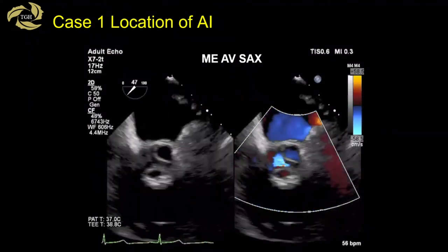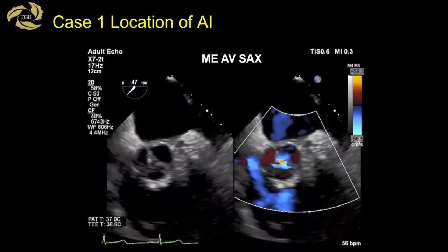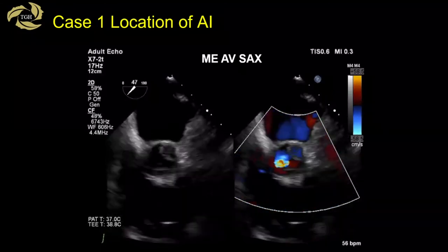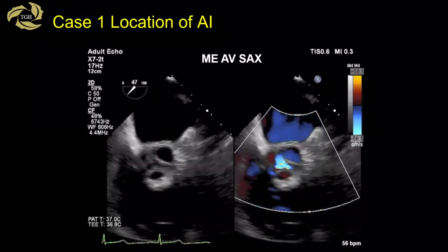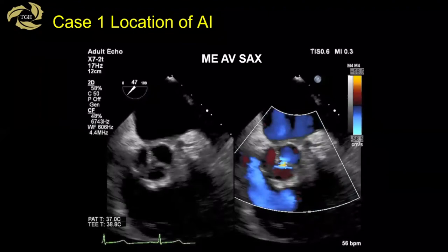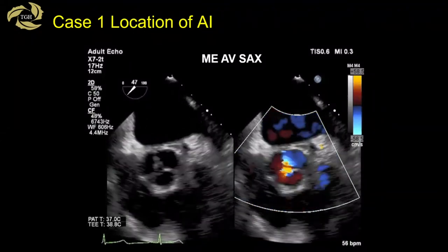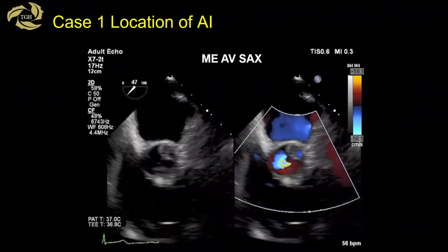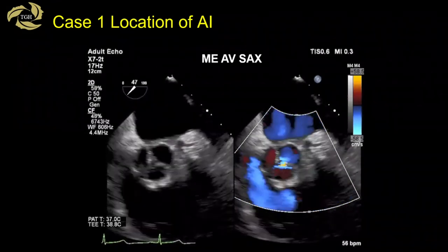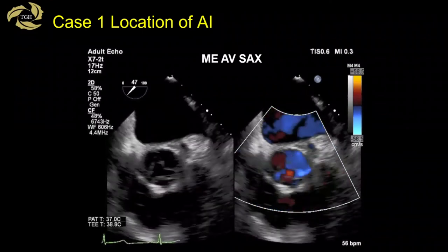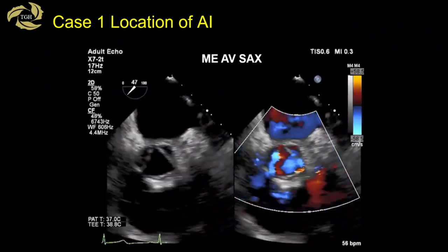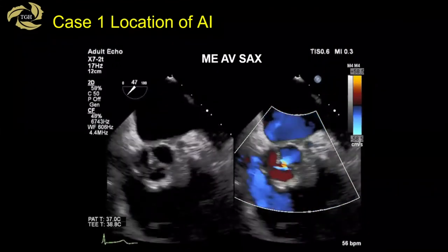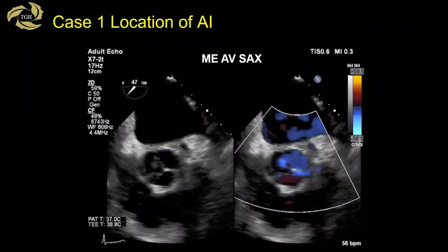In the short axis view — the mid-esophageal aortic valve short axis with color compare — the aortic valve and root seem relatively normal in size. We can see three cusps that open well. However, when they close, there is malcoaptation in the center — central malcoaptation — and not surprisingly, this is where the jet of AI originates. So we have a patient with central AI.